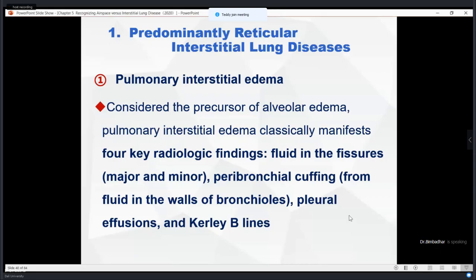Now, if I see opacities within the interstitium in a patient suffering from congestive heart failure, how can you recognize this patient from the symptoms, or how can you understand from this? If I say there is increased capillary pressure, I can see opacities within the interstitium, right? That is what I say.